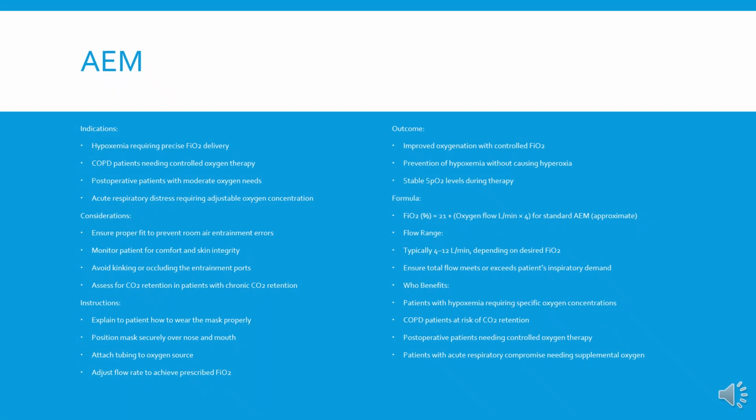AEM. So indications for an AEM are hypoxemia requiring precise FiO2 delivery, COPD patients needing controlled oxygen therapy, post-operative patients with moderate oxygen needs. A couple considerations are to ensure proper fit to prevent room air entrainment errors, monitor patient for comfort and skin integrity.